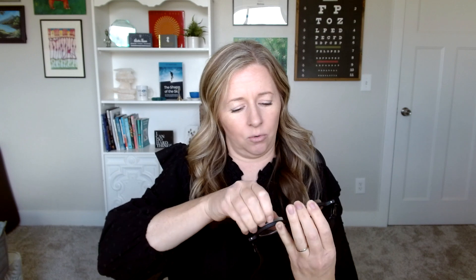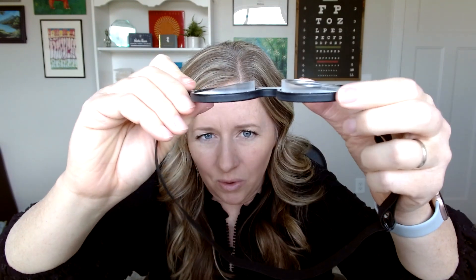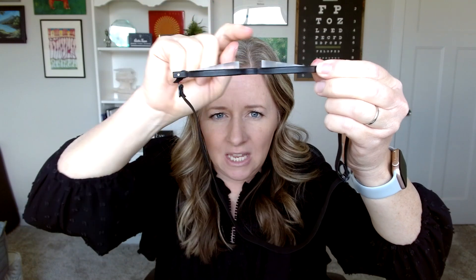With base-out prism, the image shifts towards the inside. For me with esotropia, base-out pushes images in and matches where my eyes are so I can get fusion. The goal of prism is to get better fusion, especially if you have double vision. Another common configuration is base-in — for somebody with exotropia where one eye goes out. Base-in shifts images towards the outside to match where the eyes are, so both eyes end up seeing the same image and the brain can work on fusion.